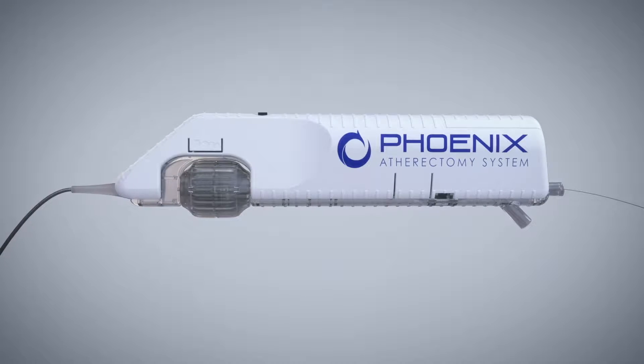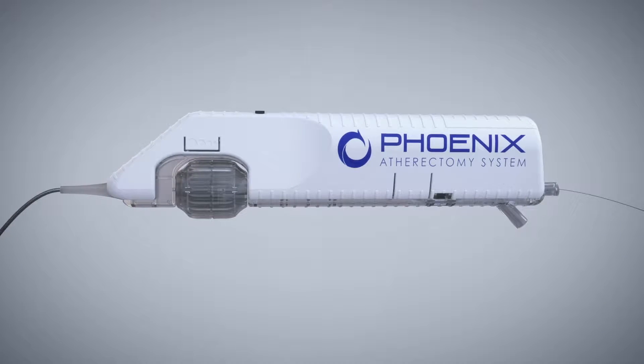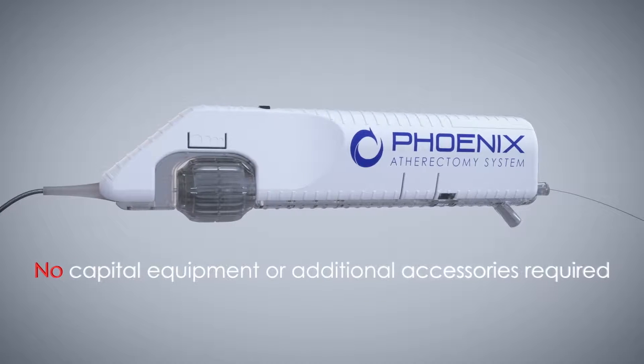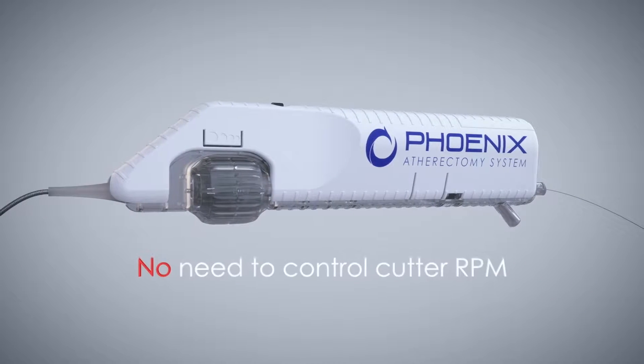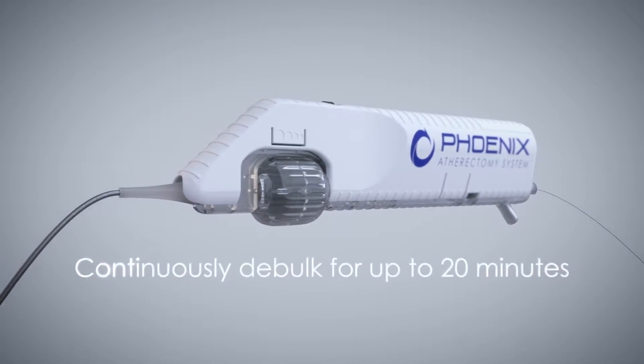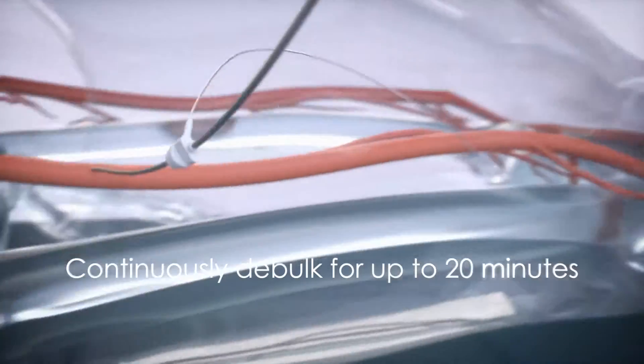The Phoenix is a simple to use system that is powered only by a motor within the handle. No capital equipment or additional procedural accessories are required. Phoenix operates without the need to control cutting rpm and can continuously debulk for up to 20 minutes.